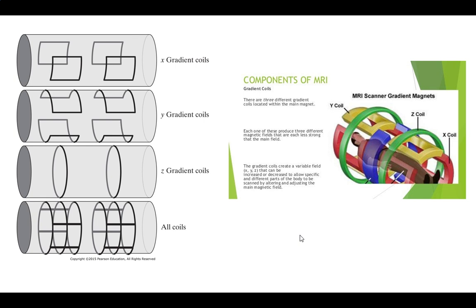They're definitely coupled. We'll see a couple places where we move Y and X simultaneously, because essentially the Z coils are just going to select where you are spatially top to bottom, so it selects a slice. And then the X and the Y are going to allow you to scan basically on how you move through them. We'll look at the pulse sequences to do that, but that's really going to be the key. We'll set these to find out where within the body a slice is, and then by setting appropriate patterns of these, we'll actually move through the space to do readouts.